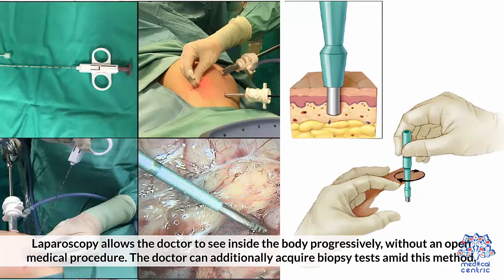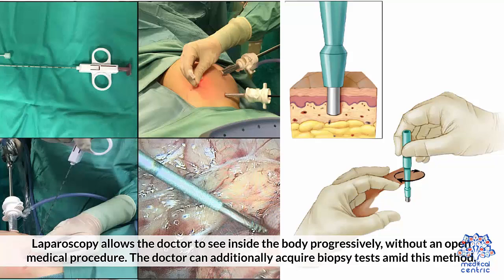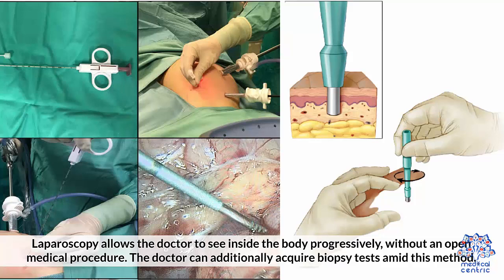Laparoscopy allows the doctor to see inside the body without an open medical procedure. The doctor can additionally acquire biopsy tests during this method.